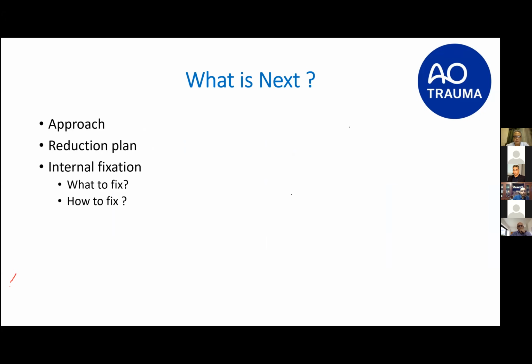Very good. I have just a concern for arthroscopy, and I would like to ask Nasef as well about this technique, because I used ankle arthroscopy with ankle trauma in some patients for isolated medial malleolus fracture, not such complex injuries. So is it worrying to do arthroscopy with syndesmotic diastasis and the possibility of extravasation and having some problems with extravasation of fluid, especially with such significant trauma? This is always the concern for anyone who is going to be doing arthroscopy.